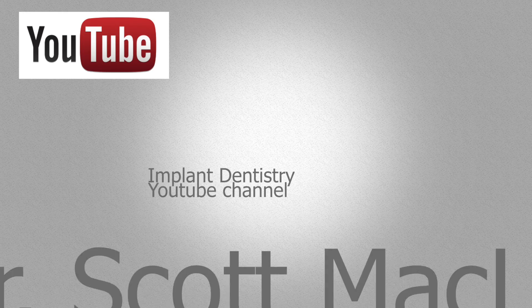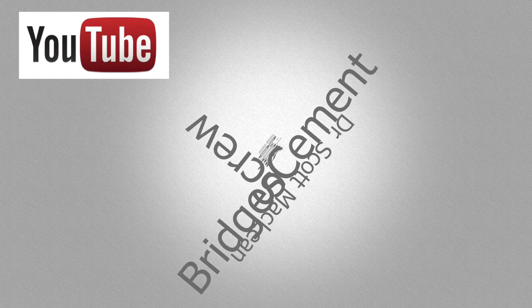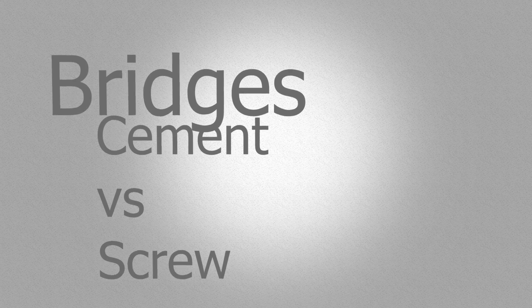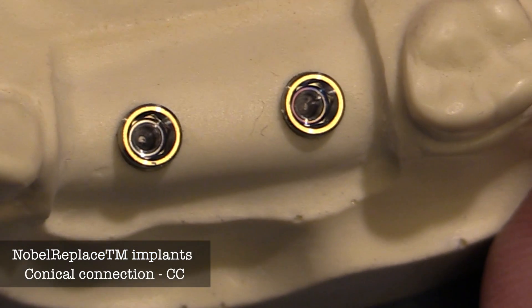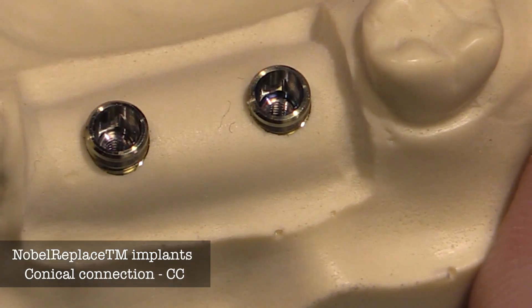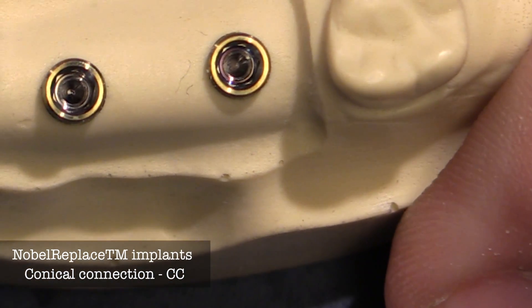This is Dr. Scott McLean and this is a YouTube video called implant dentistry. Today we'll be discussing the various methods to make an implant supported bridge. During this demonstration we'll be discussing the conical connection — using two implants makes it a bit more tricky, but it's important to know the different ways you can connect these two implants together.